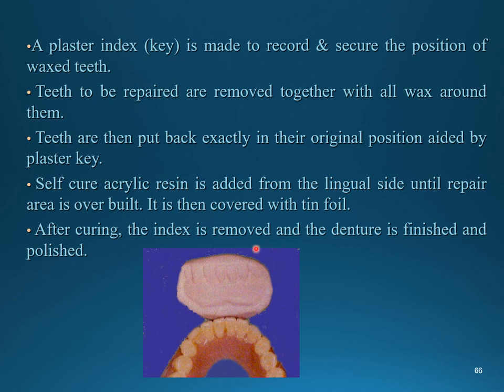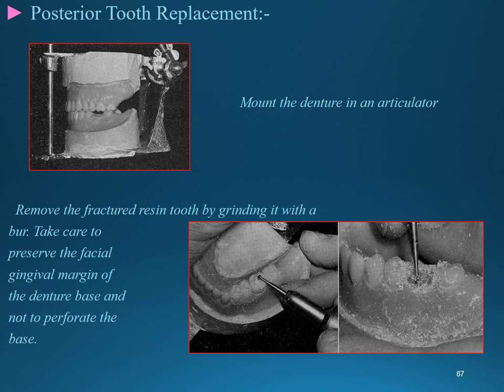Another method for the same situation is using a plaster index (key): a record is made to secure the position of wax and teeth. Teeth to be replaced are removed along with all wax around them. The teeth are then replaced back in exactly the original position aided by the plaster key. Self-cure acrylic resin is added from the lingual side until the repair area is overbuilt. After curing, the index is removed and the denture is finished and polished.